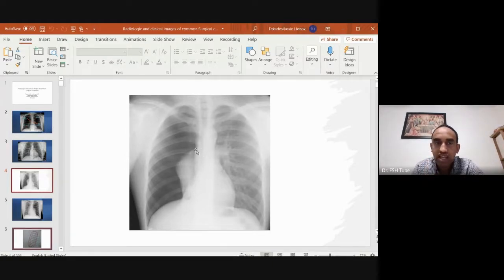So you don't see any lung, right? So this is all collapsed. Excellent, Meron. Yes, with right middle lobe collapse. No, with that, it's not right middle lobe collapse. The entire lung has collapsed. There is no lung tissue here. All this is the air in the pleural cavity, okay? It's completely collapsed lung. So this is the lung. It has become almost white as heart, right?